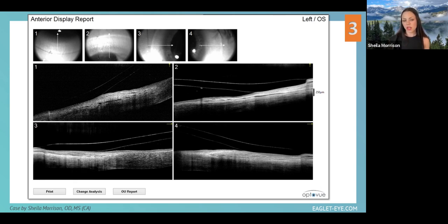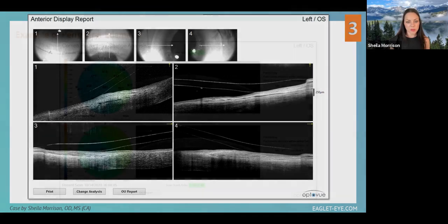On these eyes, whenever possible, I always use data-driven freeform. A lot of the time we can utilize data to also order lenses that are not necessarily freeform, but that are data-driven. With almost all manufacturers, we use a lot of our Zen lenses and our One Fits and our Boston Sights, and we utilize the data to help design those peripheral curves in ways that are better than this. But you can see that presents a big problem in this patient.